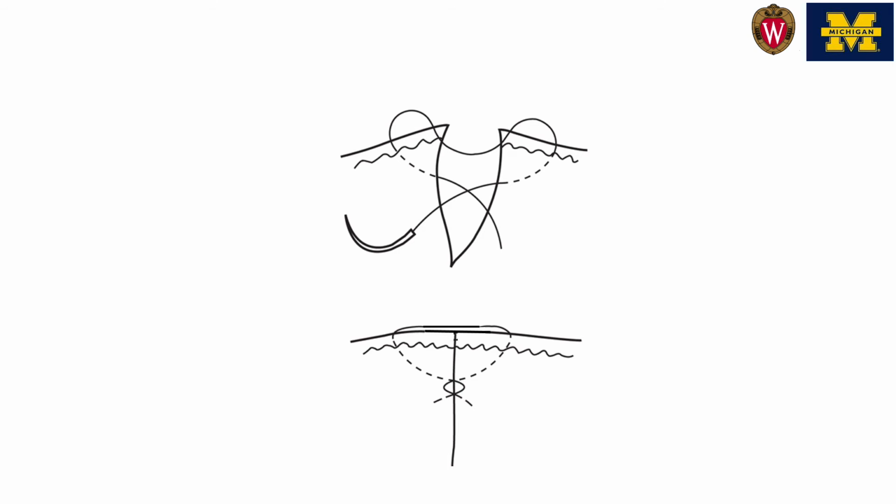And the knot should naturally fall into the suture, and this allows for more comfort for the patient because they should only, with their tongue or gums, feel the flat suture without feeling the knot, which should be tucked naturally into the incision. Usually after I've completed putting the suture down, I'll take the iris scissors and gently tuck the knot back into the incision if it is protruding a little bit. The total incision should run about half the size of a thumbnail or about half a centimeter.